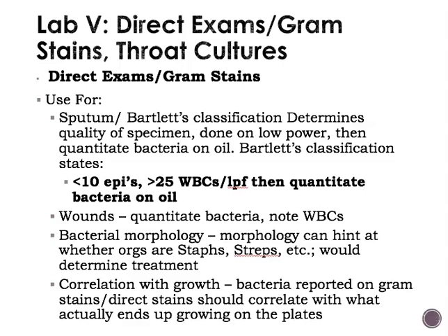Okay, sputum, Bartlett's classification. So you use the gram stain to determine if the sputum sample is a true sputum that came from deep within that patient's chest, or if it's just spit. It's done on low power. Bartlett's classification is for sputum samples only. You cannot use this quality criteria for any other type of sample other than a sputum.